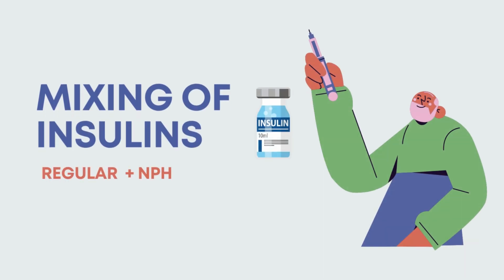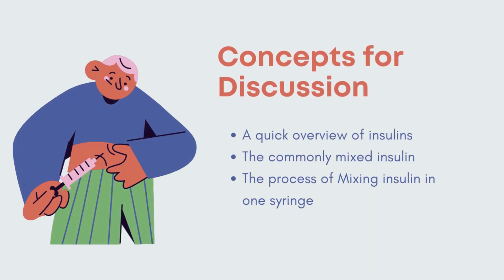Hi everyone, welcome. So today we're going to be talking about how to mix two insulins in one syringe, which is commonly our regular and our NPH. We are going to start by looking at a quick overview of insulins, just refreshing your mind on that. And we'll talk about these two commonly mixed insulins. And finally, we will look at the actual process of mixing insulins in one syringe.